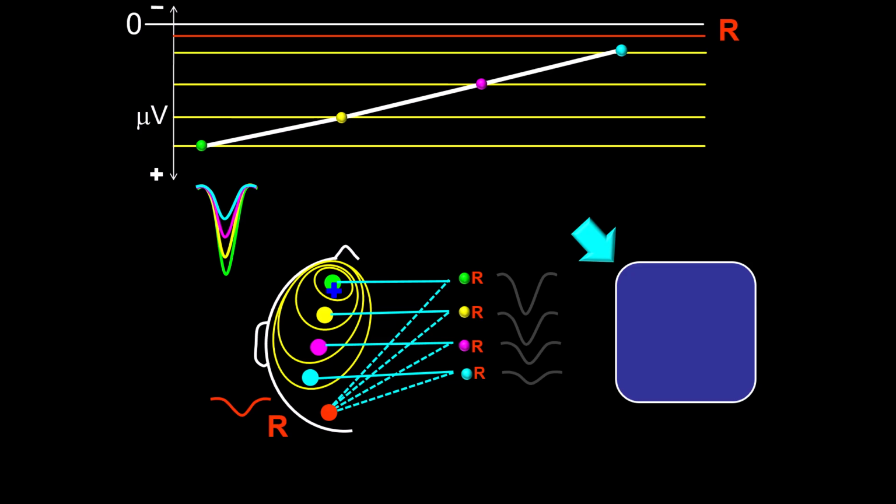That is, in this blue box, I will show what happens when we connect the non-reference electrodes to differential amplifier input 1 and the common reference electrode to input 2 of the differential amplifiers. I'd like to direct your attention to the reference electrode at the isopotential map.